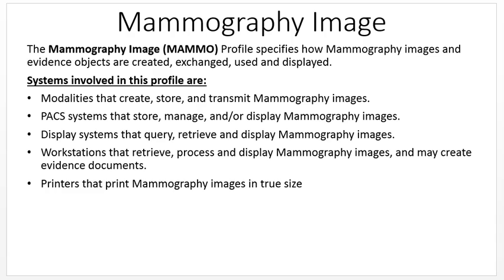The IHE mammography image profile ensures the acquired digital mammo images contain all relevant information that is necessary for further image processing, application of CAD, storage, display, review, and printing. This profile is absolutely necessary for generating correct digital mammography image content to ensure optimal presentation of images at a mammography review station.